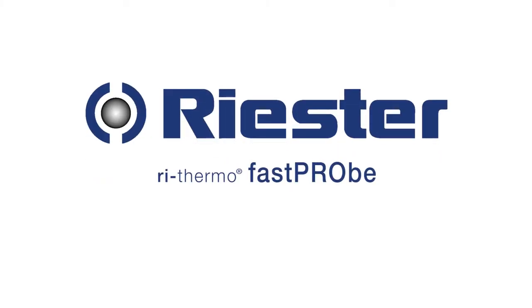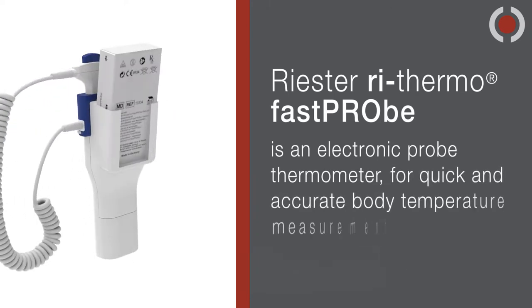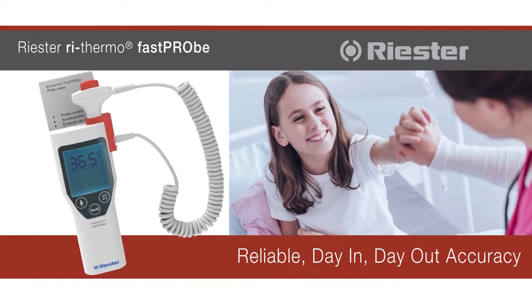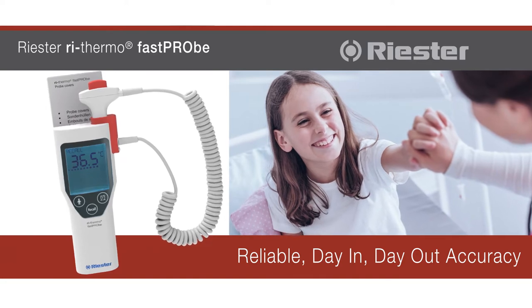The ReSTER ReThermo Fast Probe is an electronic probe thermometer for quick and accurate body temperature measurements, designed for professional use in the daily routine, offering oral, rectal, and axillary temperature measurements.